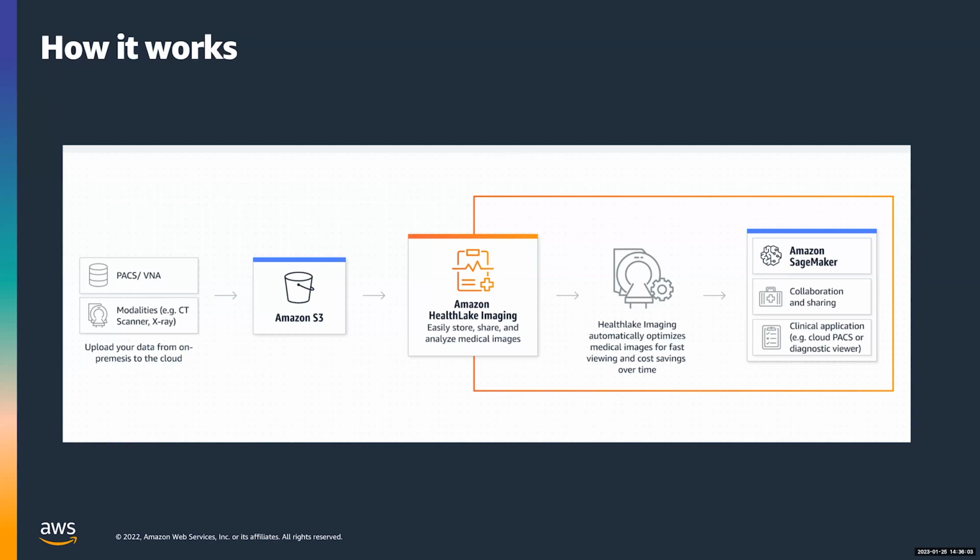So that gives you the ability to speed up your workflows by not necessarily downloading the entire dataset, but only maybe the first few kilobytes of every single DICOM object, or let's say pixel data for the DICOM object. And then with that, you will have sufficient enough information to start training your model on top of.